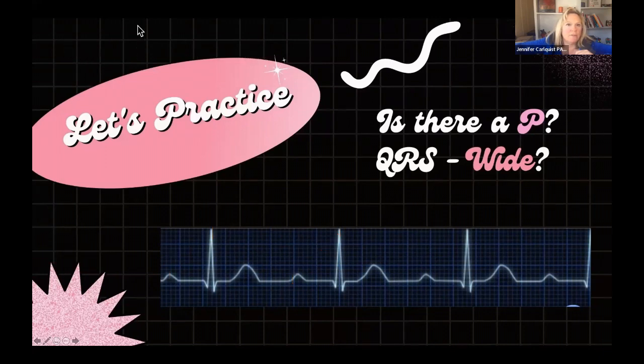And you can tell that the family is not getting along. Yes, Vanessa says family is not getting along. It's mostly the mom and the dad, right? They're just not getting along. The dad's still hanging out with the baby, but the mom and dad are just not seeing eye to eye. Now, first degree blocks, what do we do about them? Not a whole lot. We watch them. We make sure they don't progress, but in and of themselves, first degree blocks are not dangerous. They can progress, right? So we're always keeping an eye on them.